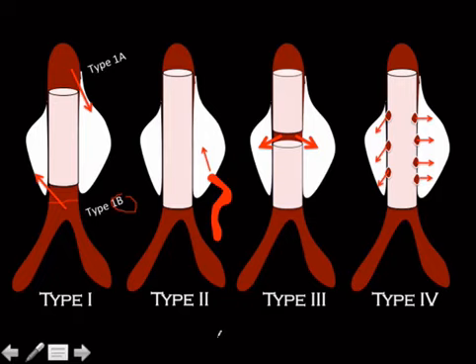Type 3 is if you've had fracture of the graft itself or the components disengage from each other. The most common situation where I've seen this is when you have an iliac part and an aortic part, and the iliac part disengages from the aortic part, and then it's like falling apart, and you have sac sizes increasing, and you've got contrast outside of that there.